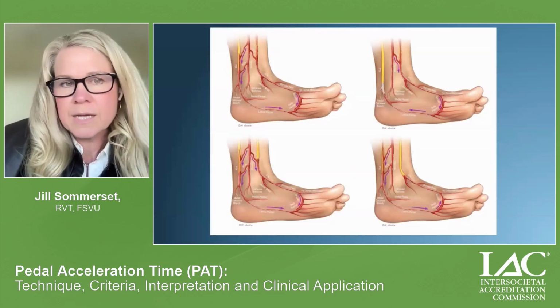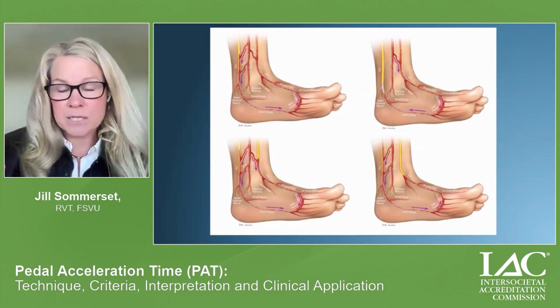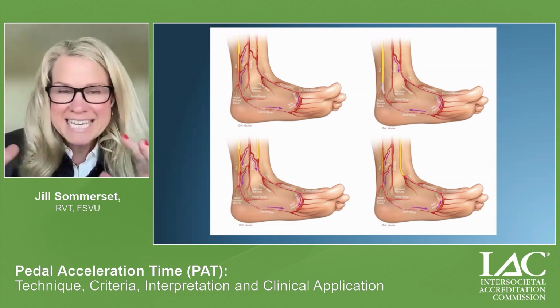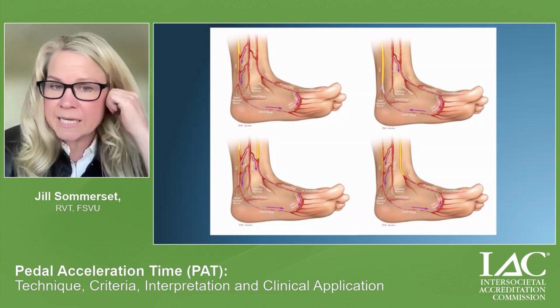So when we put all this together, we talked about the communicating arteries, the pedal arch, PAT, you start to really understand the pedal hemodynamics, which is really valuable in the setting of CLTI.